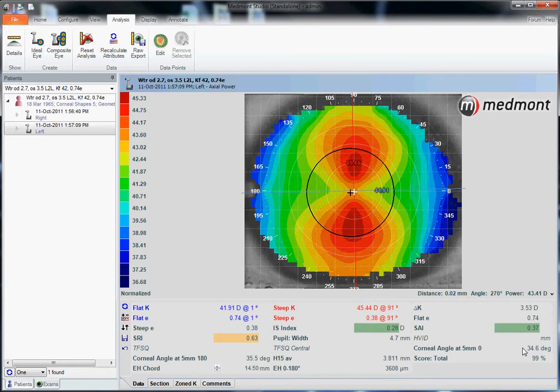That's just a simple example — there are many more things these angles can be used for. We can also see an attribute has been calculated for the horizontal meridian at 15 millimeters out, providing us an estimate of the sagittal depth of the anterior chamber: 3.811 millimeters.